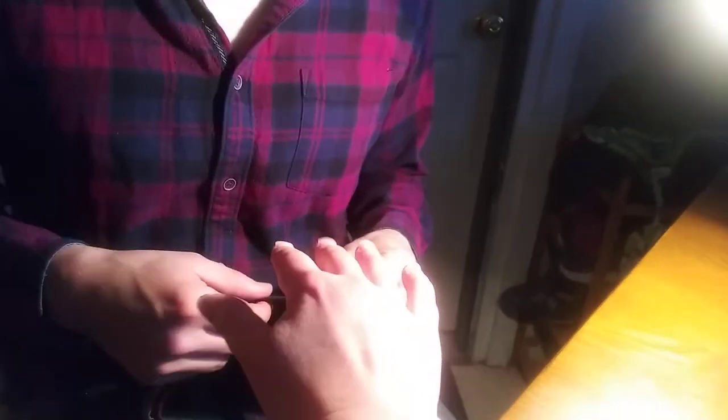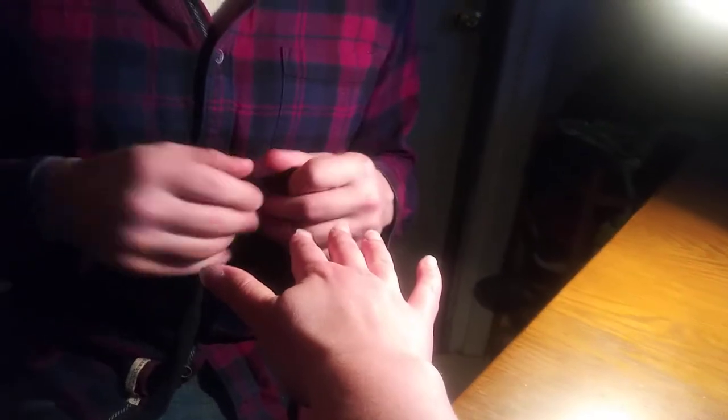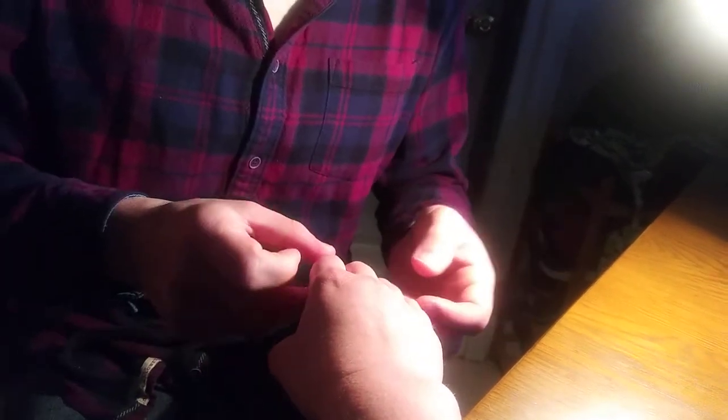This is Tristan Cray, a PTA student. I'm about to do a figure 8 edema measurement on the hand. I'm going to first ask you to just relax your hand and keep your fingers together like that.